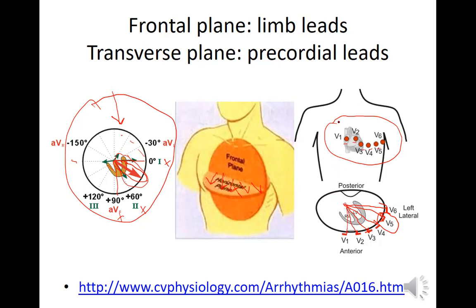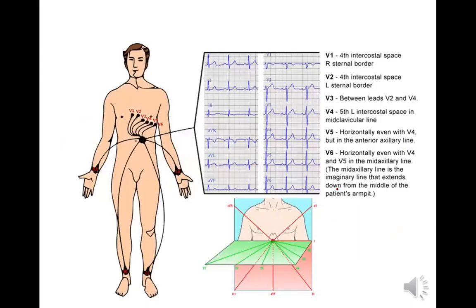So you'll see these are the electrodes that we're putting on the chest here. And we'll go through that placement again. So always put the positive signs. I like putting the positive signs in there to show what you're actually looking at. And then for the negative, we'd have to draw these lines out and put negatives all in the back. There's a good picture of that coming up too.